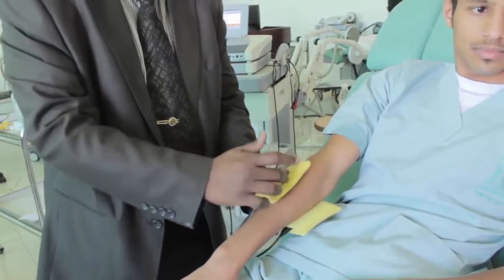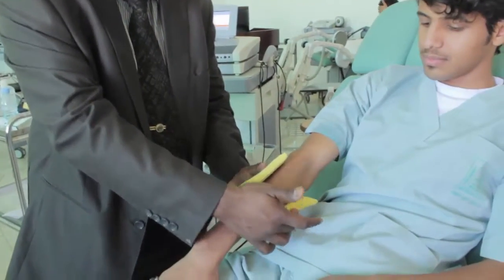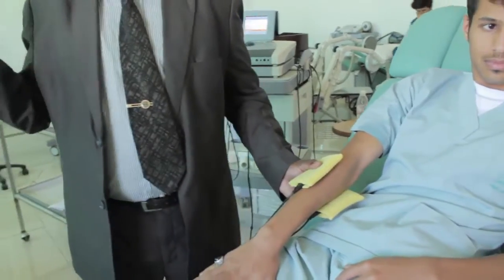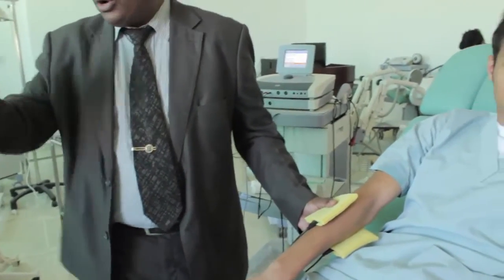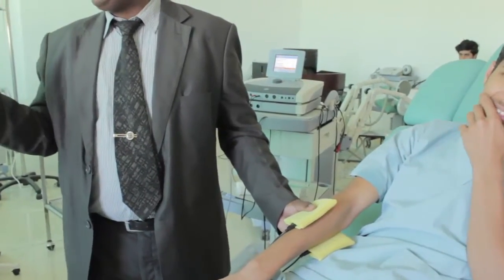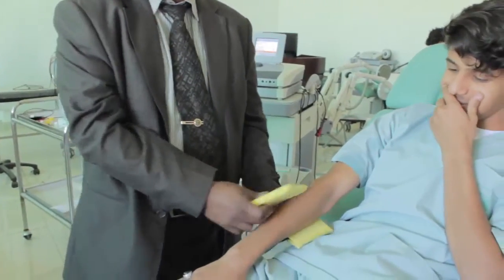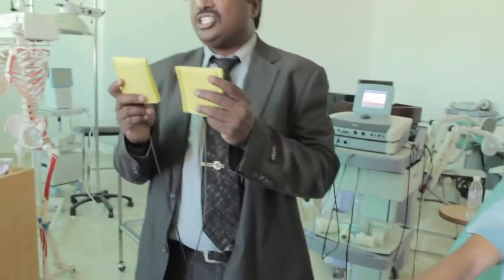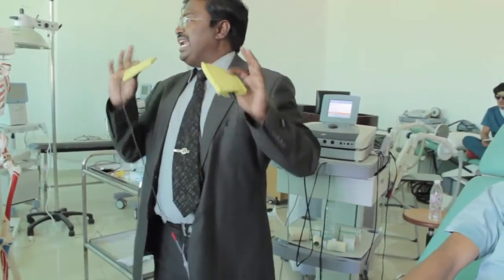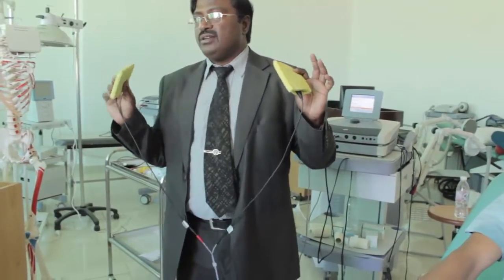If electrodes touch, the current will pass from one electrode to the other electrode without passing through the skin. No connection. So it won't pass through the body. So when it doesn't pass through the body, no effect. So the electrodes cannot touch when you apply onto the patient body. It is the golden rule for any electrodes in electrotherapy.